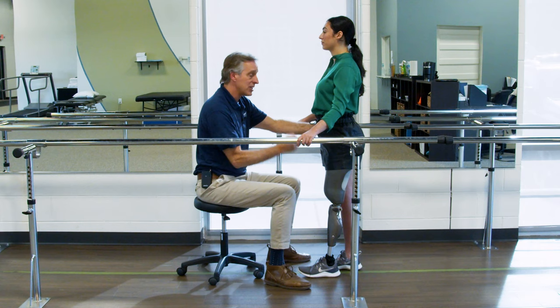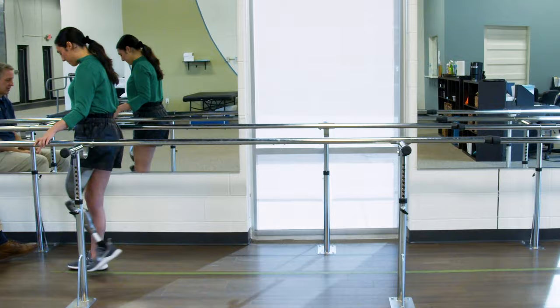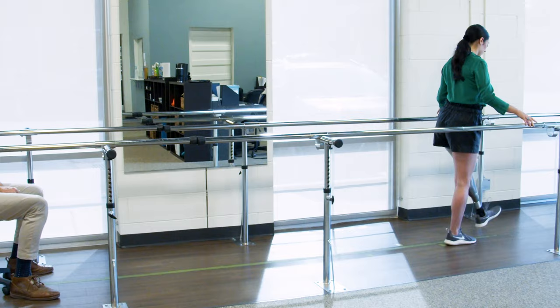So all I want you to do from where you're at right there, that leg's in front. There you go. Good. And chop down. Chop down quickly. There you go. Boom, boom, boom. Turn around. Now don't overthink it, Tracy. Once you've got it, it is simply step and chop down quickly. There you go. Chop, chop, and shorten the other step too. There you go. Faster, faster. Good, come on back.